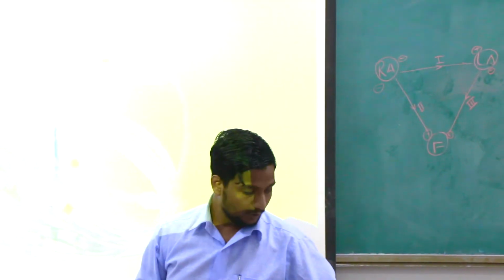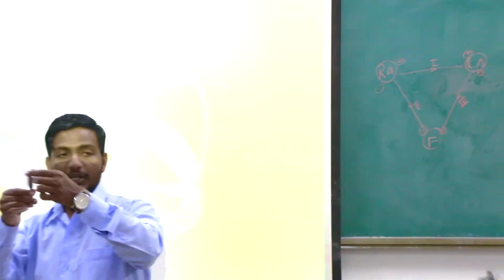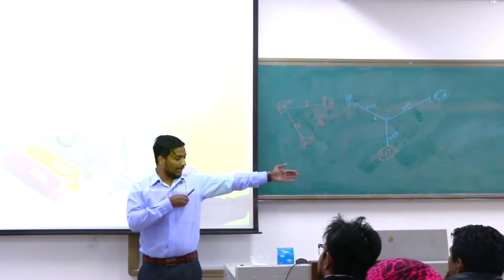So once again let me repeat. What have we learned just now? Suppose that this is the direction of the axis. So this tip is going to be the direction. And I'm going to point out and you tell me which one I'm talking about. Going from the center of my body toward my left arm.